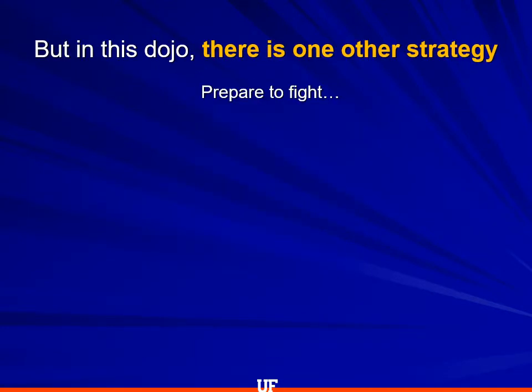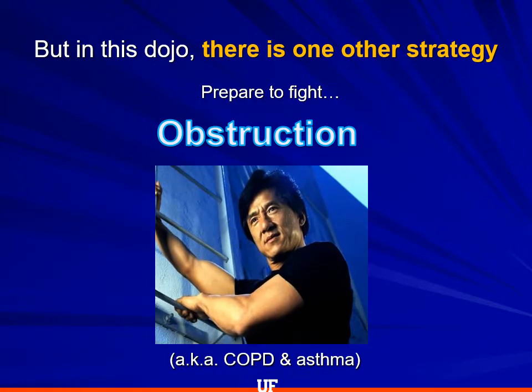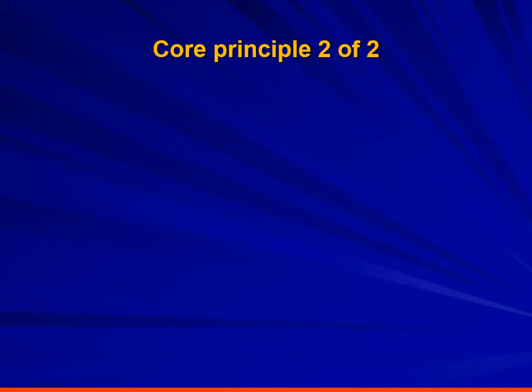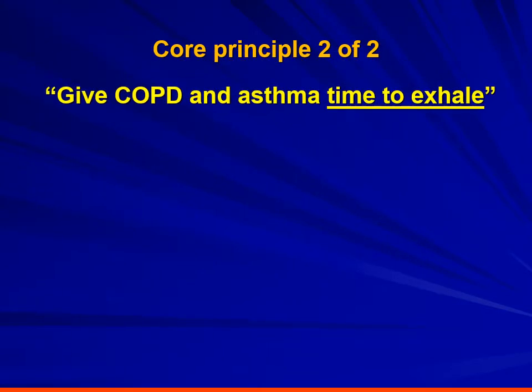But in this dojo, you must also be prepared for the obstruction group, COPD and asthma. And the core principle for this group is give COPD and asthma time to exhale.